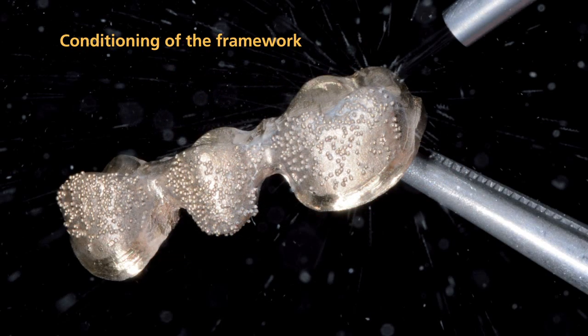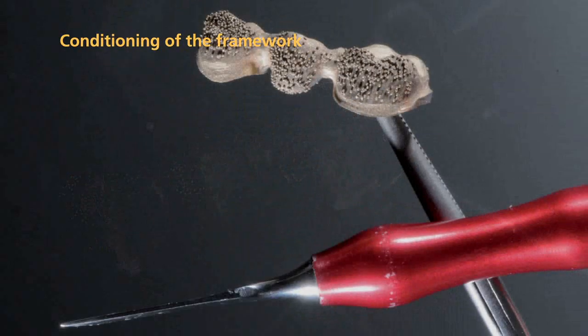When you fabricate a metal supported restoration, it is particularly important that you condition the framework appropriately before you apply the veneering material. Carefully blast the framework with aluminum oxide of a grit size between 80 and 100 microns using a pressure of 2 to 3 bar. After blasting, remove blasting medium residue by tapping it off with an instrument.